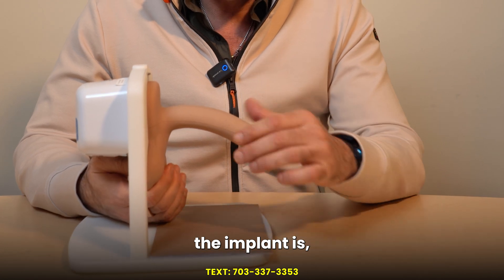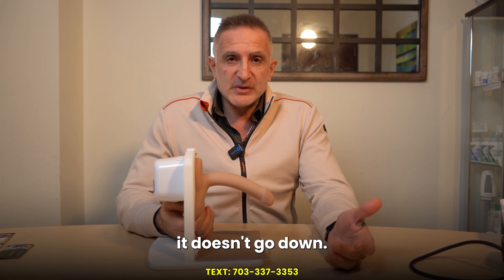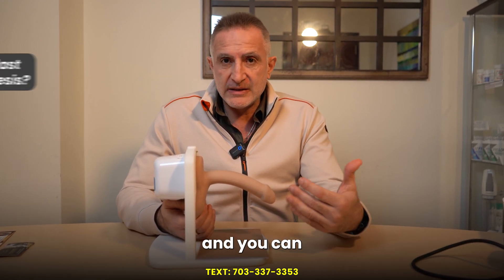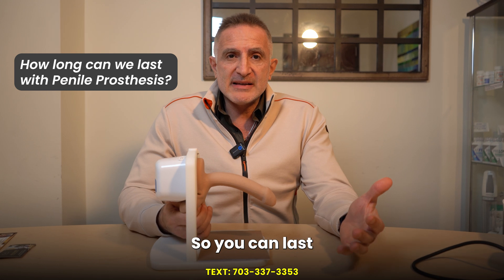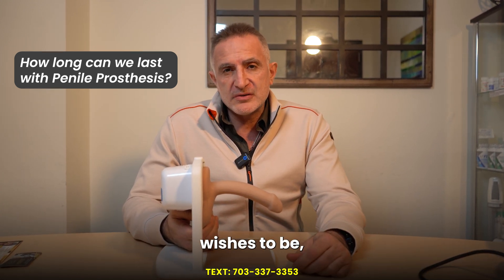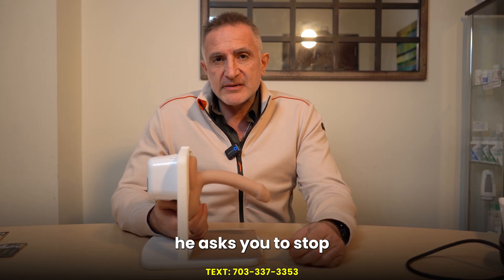The implant is inside of the penis — the outside is your own penis — and when you develop an erection it doesn't go down. You can keep having orgasm and ejaculation and you can keep going. So you can last as long as you wish to last, or as long as your partner wishes to enjoy the moments, until she or he asks you to stop.